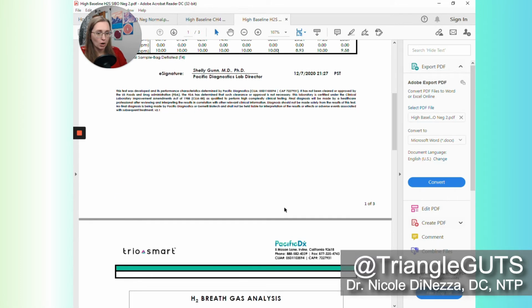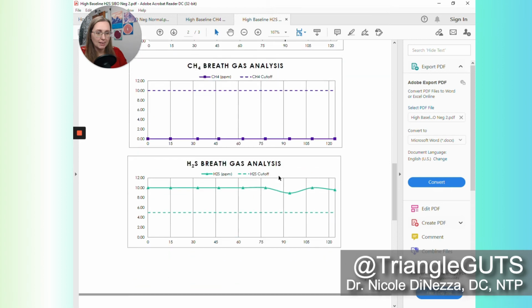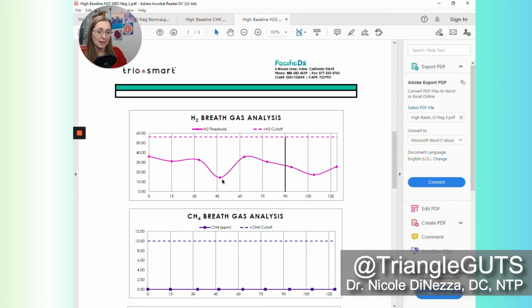But as far as we're aware, looking at the graph that they give us, this would not be intrinsically indicative of hydrogen sulfide overgrowth in the small intestine. This looks like, bare minimum, it's hydrogen sulfide overgrowth in the colon, or dysbiosis in the colon, but we can't really ascertain whether it's truly H2S SIBO based on this test. But like I said, this person would classify or qualify for the hydrogen SIBO diagnosis, in my opinion.